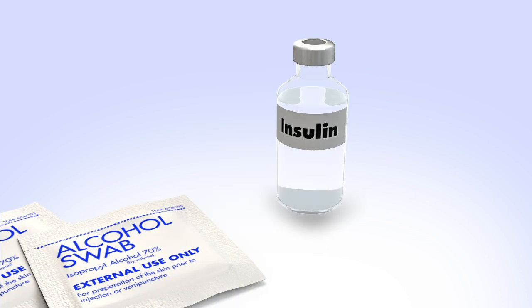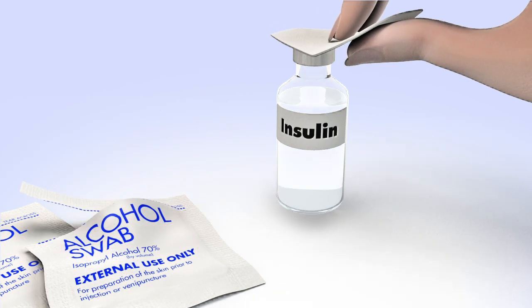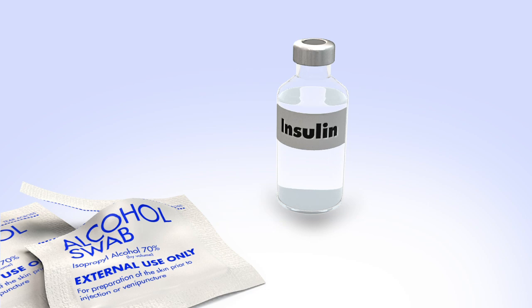To reduce the risk of air bubbles, make sure the insulin vial is at room temperature. Wipe the top of the insulin vial with alcohol and wait until it dries. Remove the new reservoir from the package.